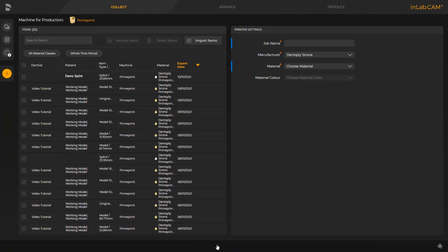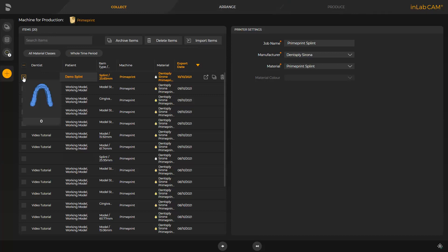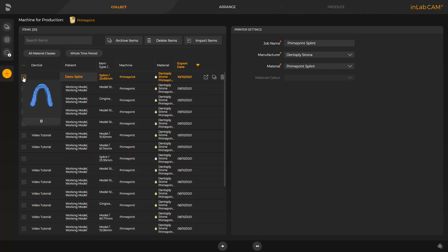When the InLab CAM software is opened, all cases previously transmitted are displayed. We select our splint, and can either select the so-called FastTrack by tapping the double arrow, or we can switch to the next phase, the Arrange phase. FastTrack will take you directly to the last phase, Produce. In this case, the InLab CAM software automatically positions and orients the print object on the build plate, and also defines the support structure automatically. Detailed information about the InLab CAM software can be found in a different video tutorial.